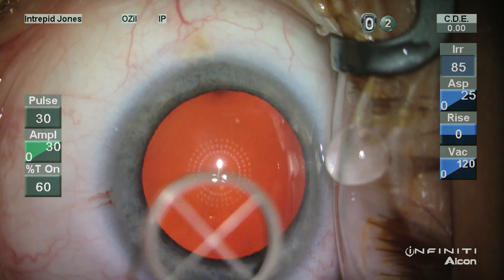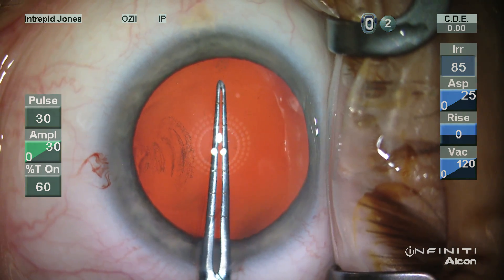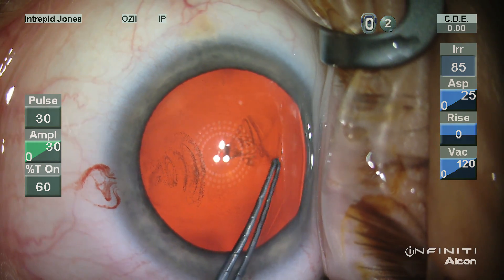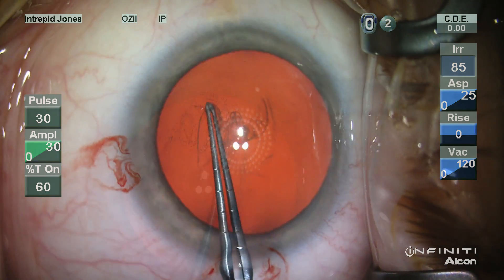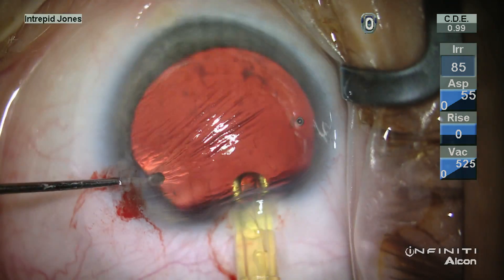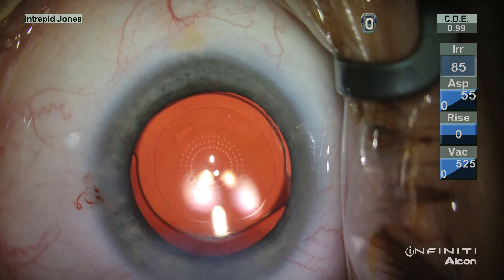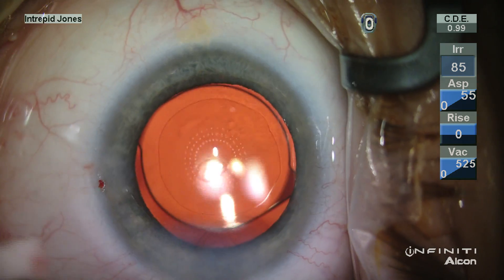Here in this highly myopic patient, we once again apply our corneal marker while the patient is fixating, judge the size of our capsulotomy, and create our capsular opening following the diagram of the corneal marker. Once the lens is in place with an inflated anterior chamber, you can notice this lens sits more nasally and the keratoscope confirms that it is well centered on the visual axis.